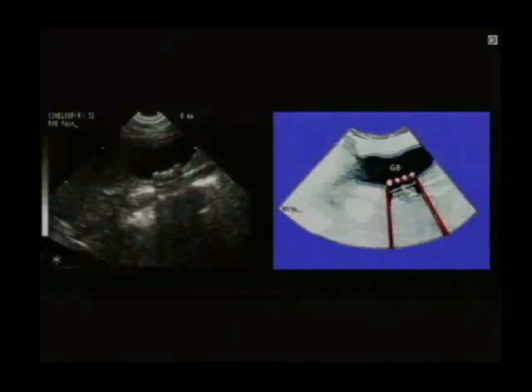So here are some other images now of the right upper quadrant. We have multiple stones with shadows here on the left side, and we have a schematic showing that as well. And again, we have multiple stones here. We have the gallbladder, which is again anechoic, and lots of shadows. Yeah, you can roll them and see if that'll move. Now remember, if a stone is stuck and inflamed, it's going to cause a problem, and it's not going to move at all.